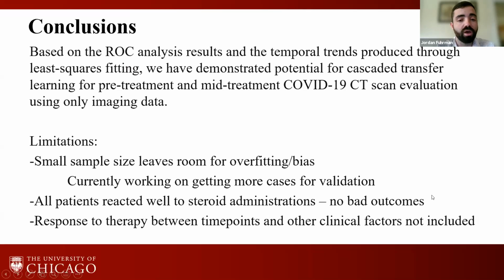And finally, as I mentioned, we only used imaging data in our model, and we could potentially get improved performance by including additional information, such as a patient's response to therapy between time points or other clinical factors.